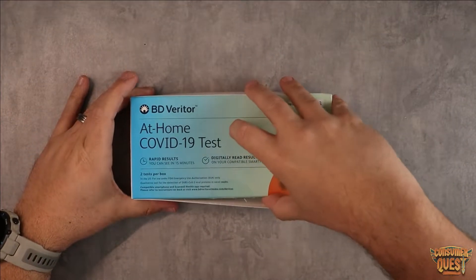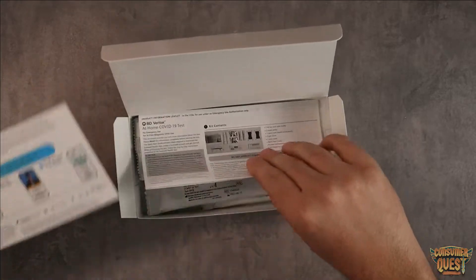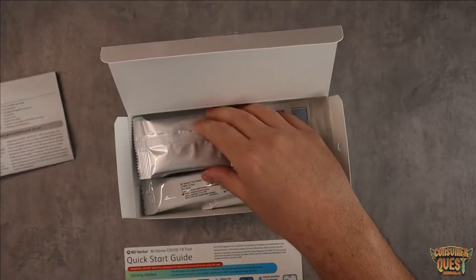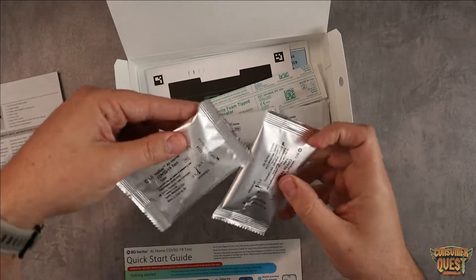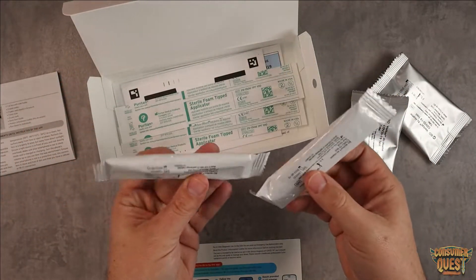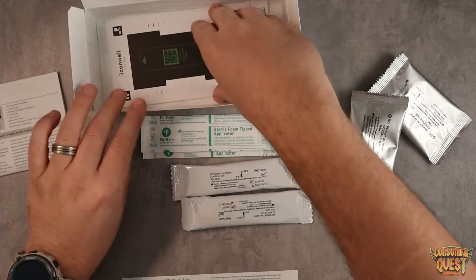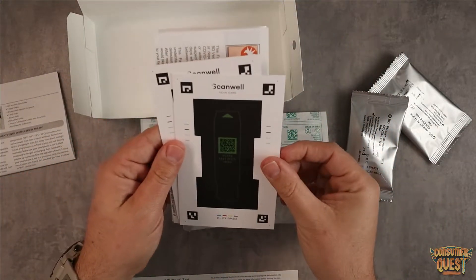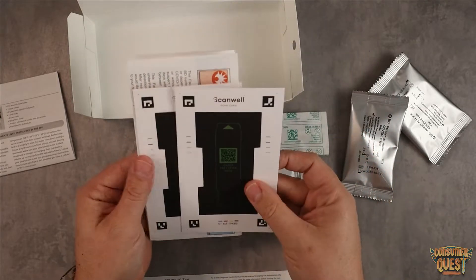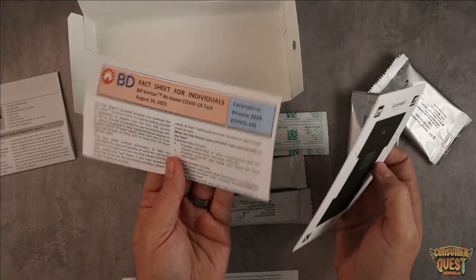Let's open up the package and see what we get. Inside we have the quick start guide which will walk you through how to actually use the test. Here's an additional instruction manual which walks you through intended use, ingredients, and all that stuff. Here is the actual testing card. These are two test tubes, two of the actual test sticks, and two swabs. And then there's some more documentation — we have the scan well card where you place your test, and a fact sheet for individuals about the coronavirus and the test.